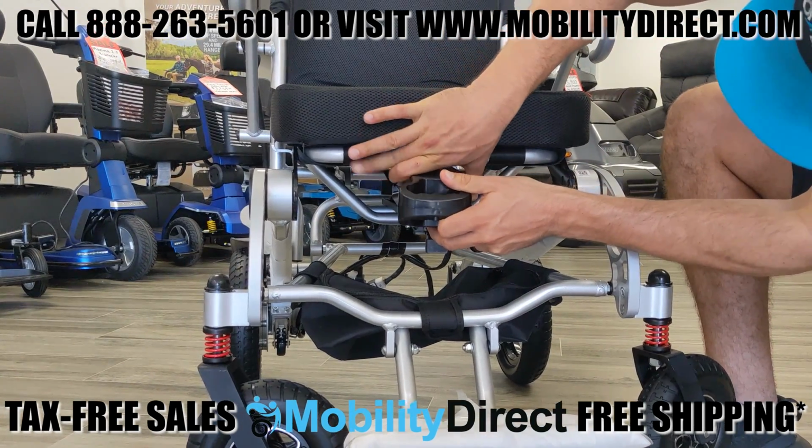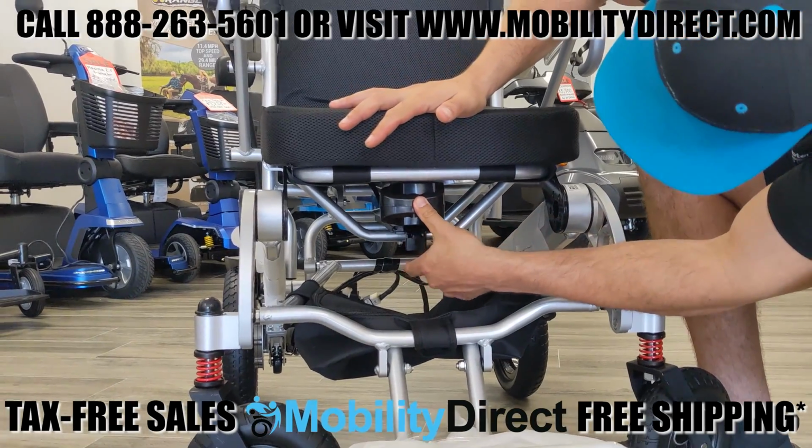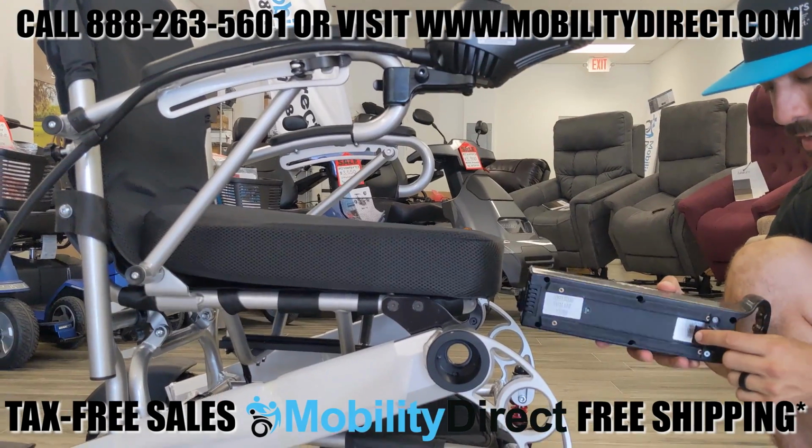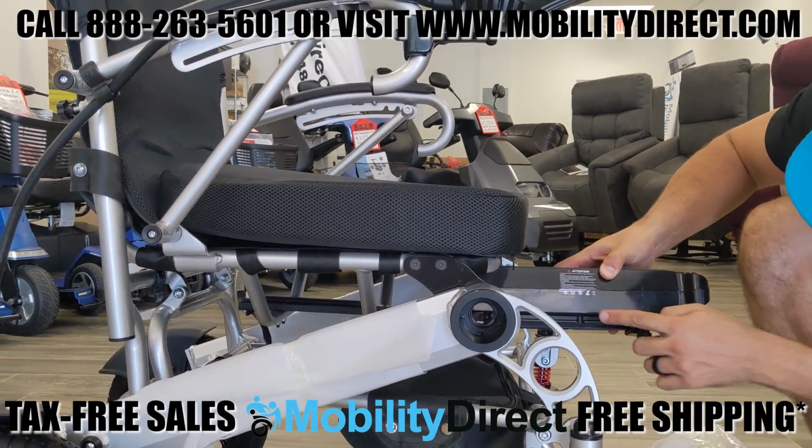It's kind of hard to see here, but you will need to grab that clip that's on the bottom with your finger and make sure to open that clip while sliding it in so that it actually locks into place.